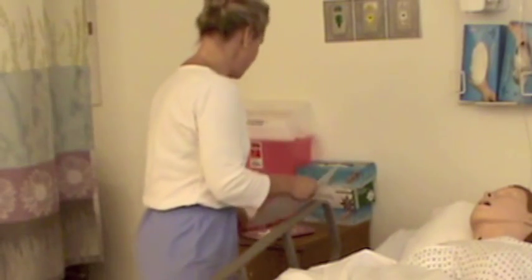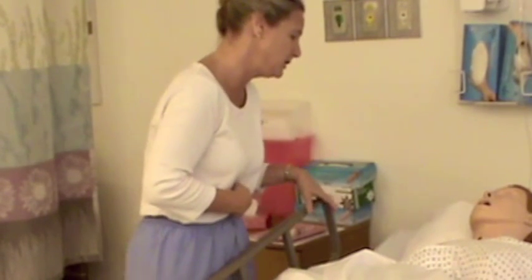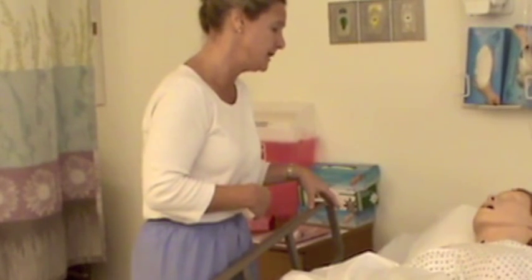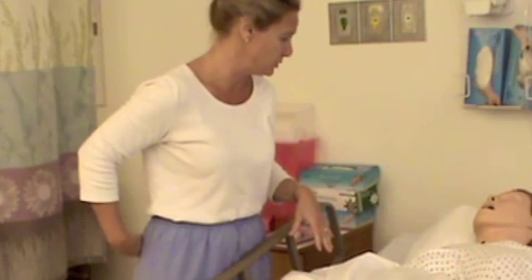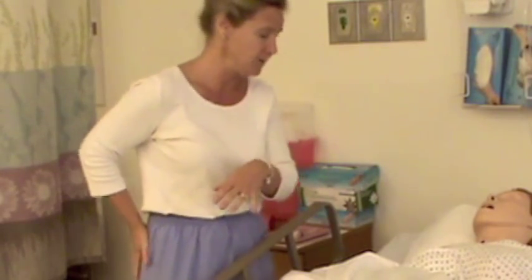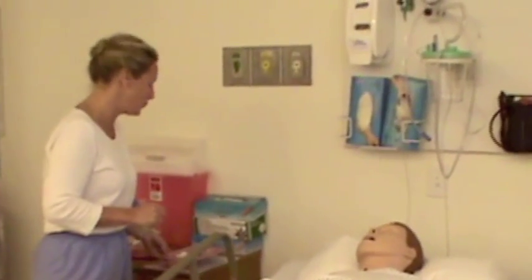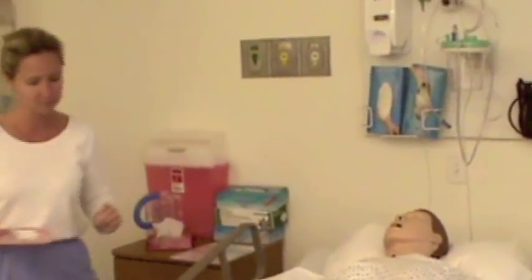I have your medication, which is the Tigan, and it's to prevent you from having further nausea. It should give you some relief. And I saw that the last place that you received this was in your right ventral gluteal area. So I'm going to go to the left ventral gluteal muscle. So I'm going to go towards your buttocks here, and I'm going to have to go on the other side because I'm going to be using my right hand for the landmark for the left ventral gluteal region. Okay.